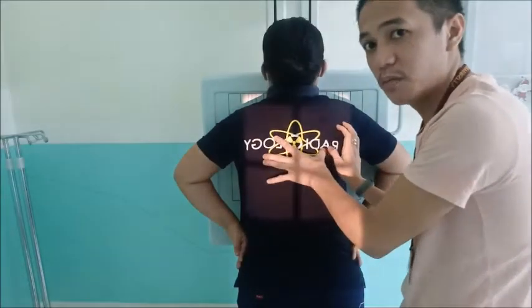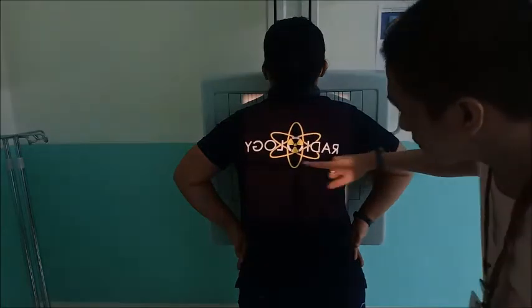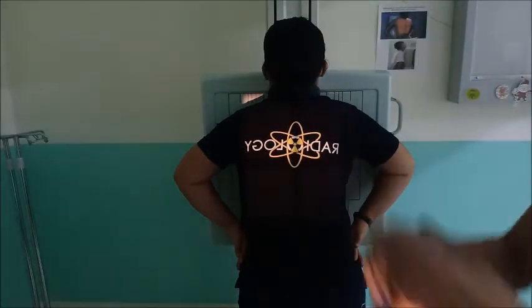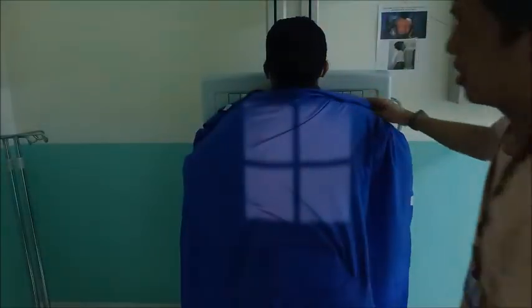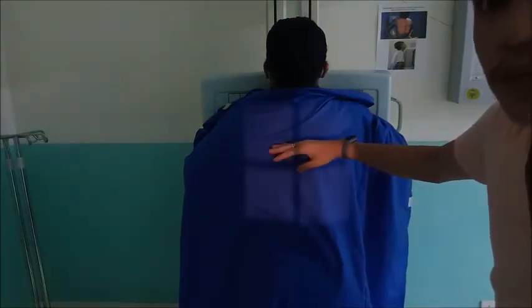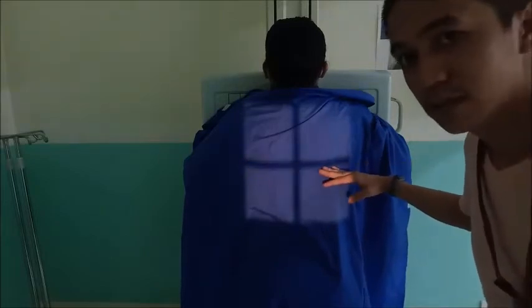Okay, the inferior border of the scapula. So that means the horizontal line is directed towards the inferior border or inferior angle of the scapula. Okay, so also at the level of T7.